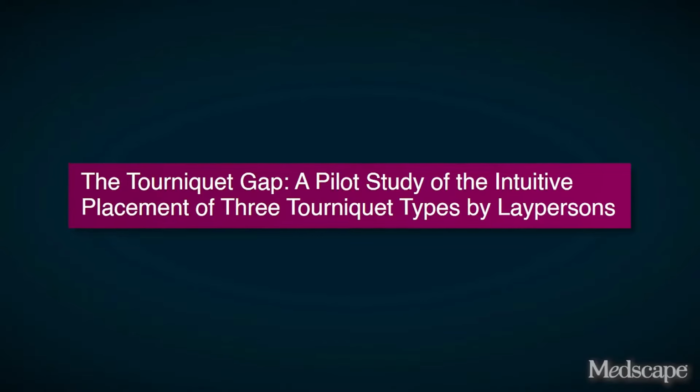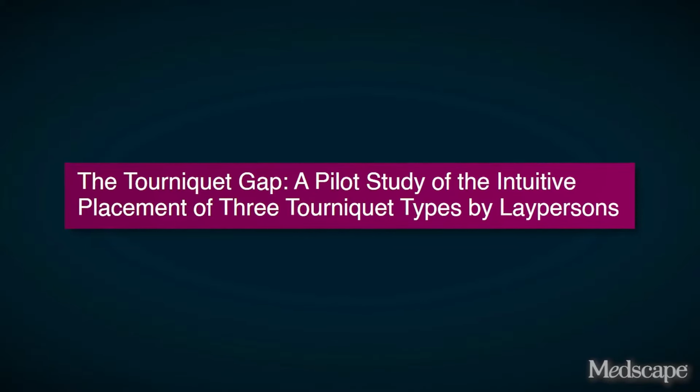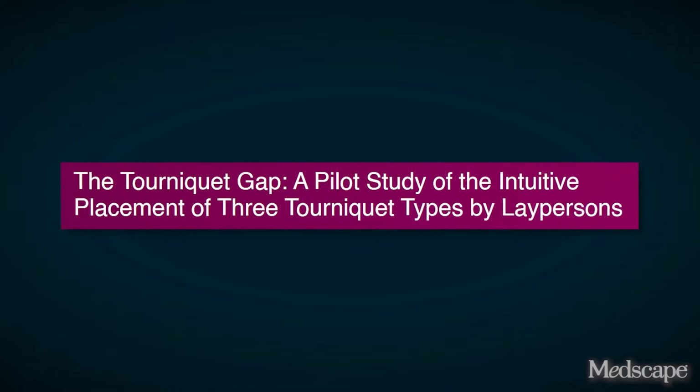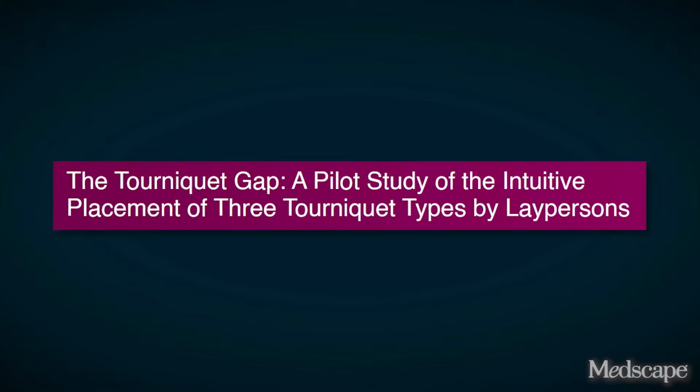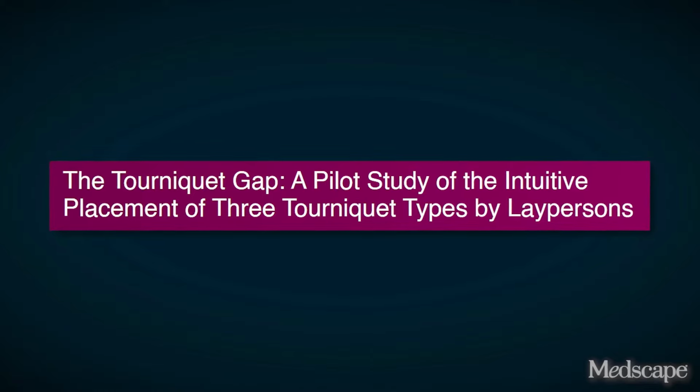So in terms of tourniquet failure, how often do standard tourniquets fail, like the CAT combat type tourniquet? Unfortunately, they fail very frequently. There are several studies that have been conducted to evaluate this. Many of them occur immediately after training, and they found failure rates between 80 and 90% for the current conventional CAT tourniquet immediately after training, which is very concerning. In terms of failure, was it the windlass aspect of the tourniquet that failed, or was it something related to the actual strap, or was that sort of in any way detailed?